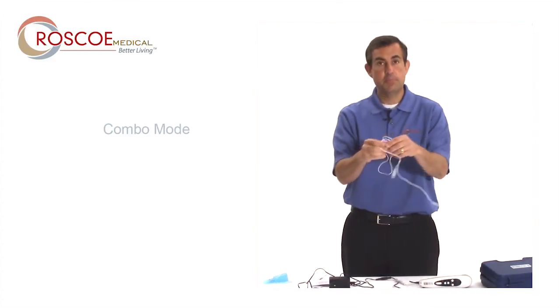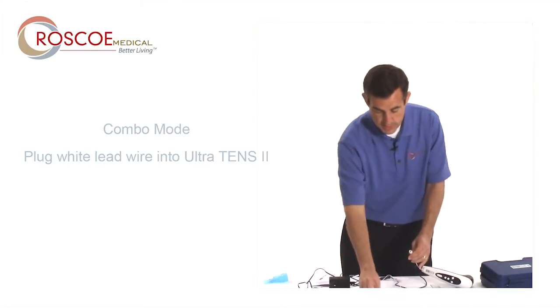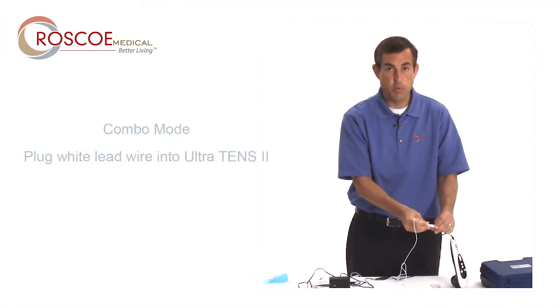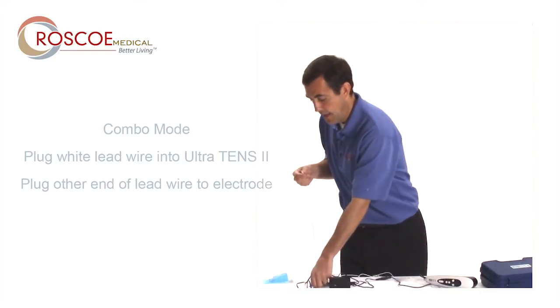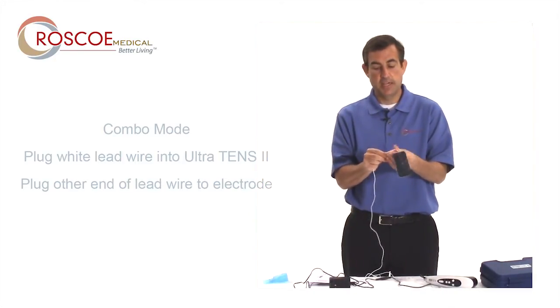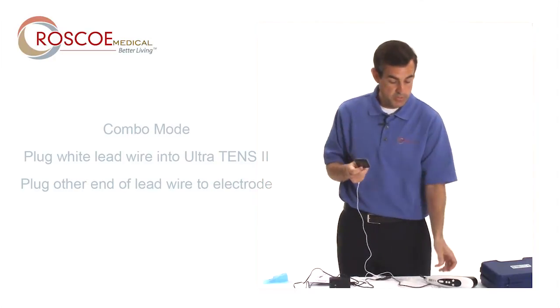For that mode, I take this white lead wire. I plug one end into the white lead wire that comes out of the Ultra TENS II. I plug the other into the lead wire, the electrode itself. This is how I use combo.